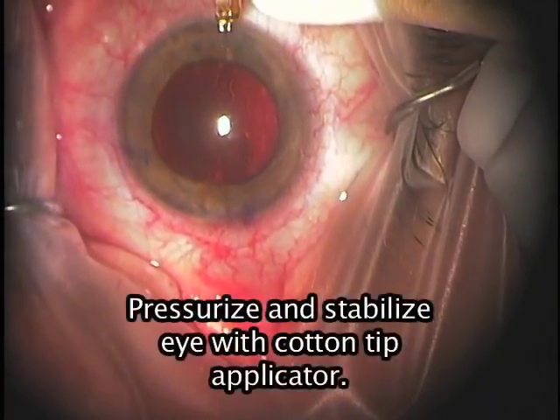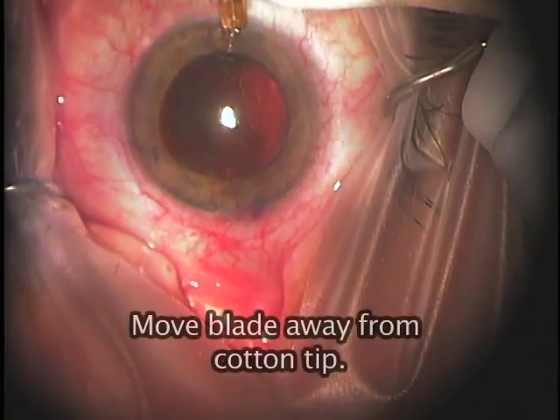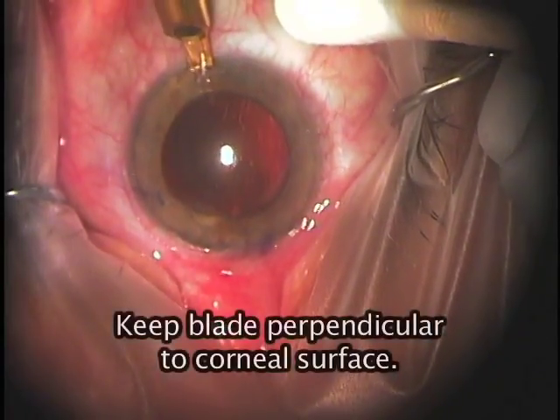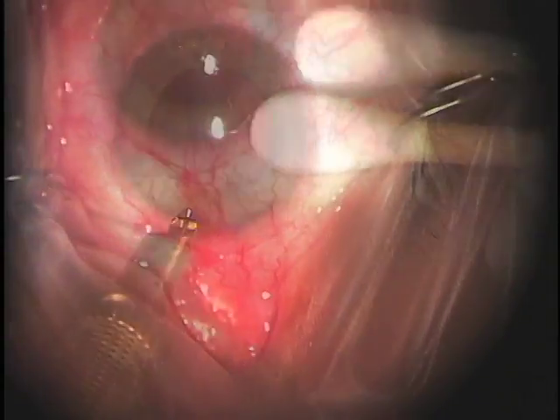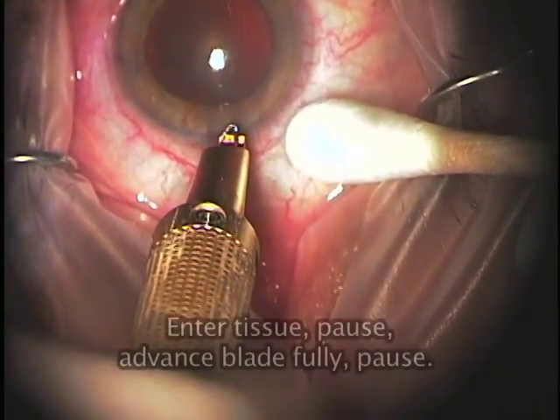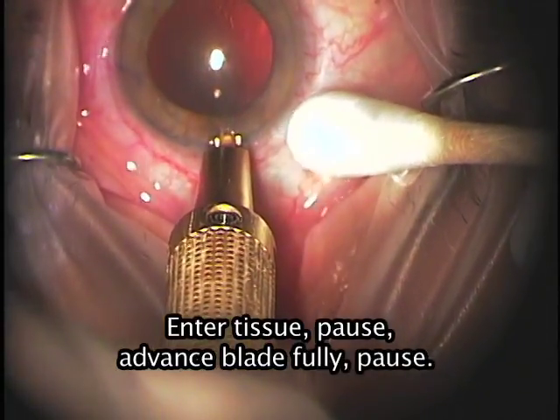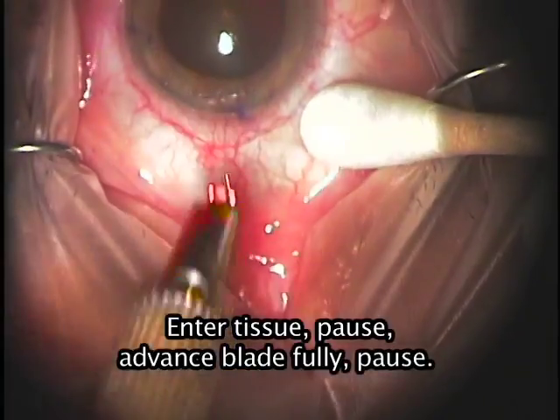When cutting the tissue, you simply connect the dots with an arc that parallels the limbus, but it's important to keep the blade as perpendicular as possible to the corneal surface because this ensures that the blade will reach the intended depth. By unintentionally tilting the blade, you're going to achieve less depth and an undercorrection. When the blade first enters the tissue, pause for a second to let it penetrate those deepest lamellae. Then advance the blade very smoothly. Before withdrawing the blade, again pause for a second to make sure the cut has been fully made.